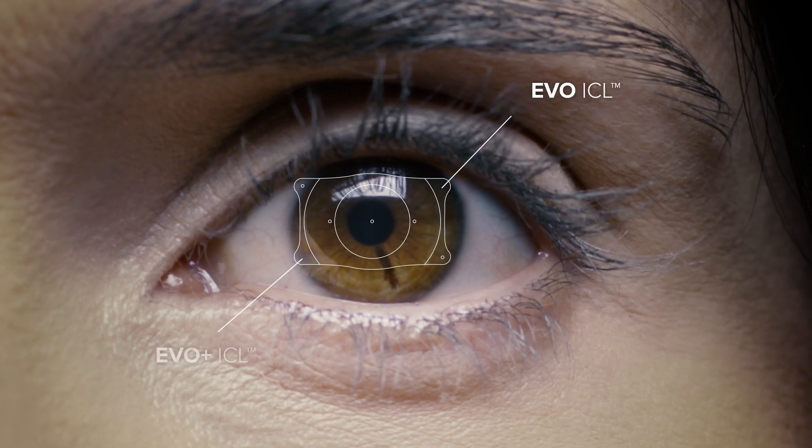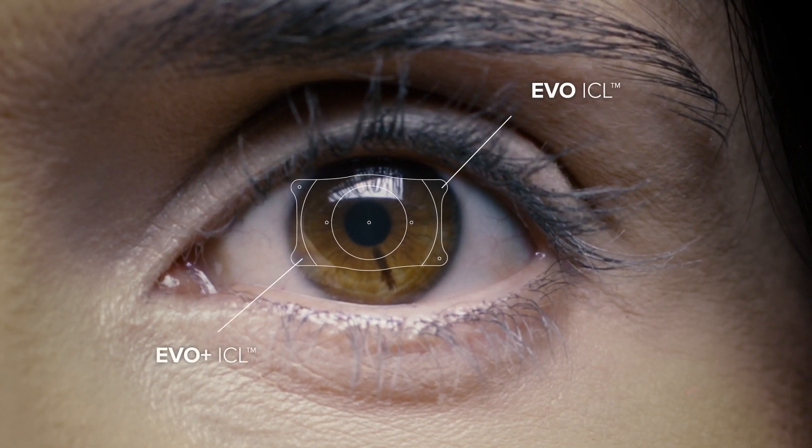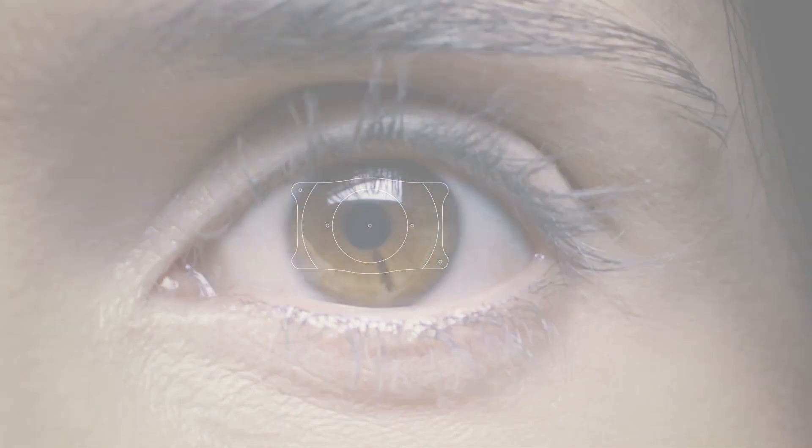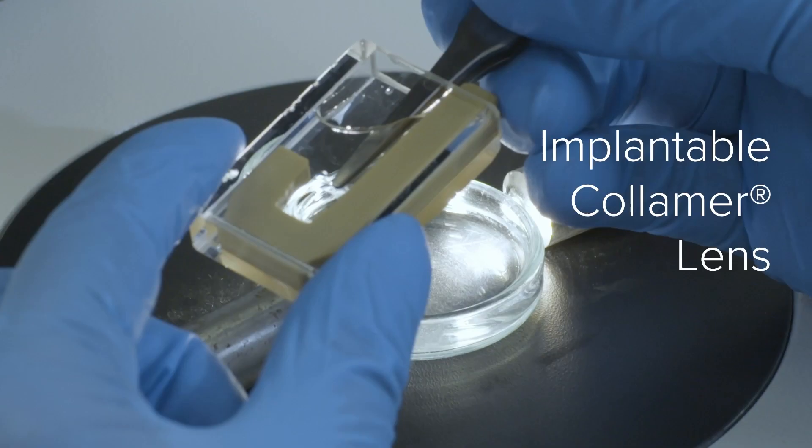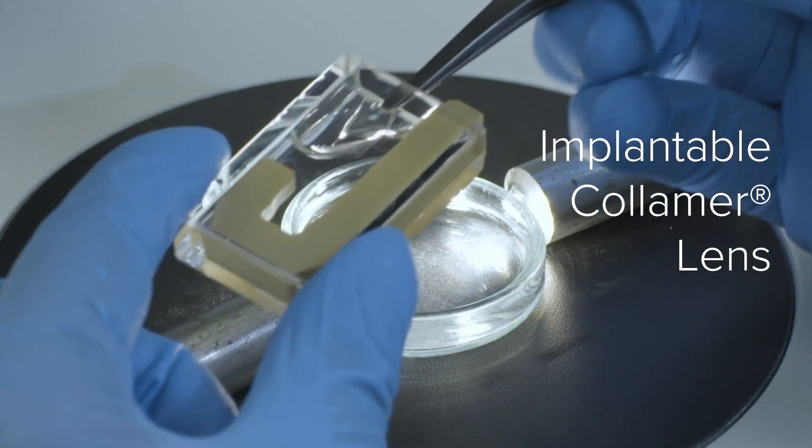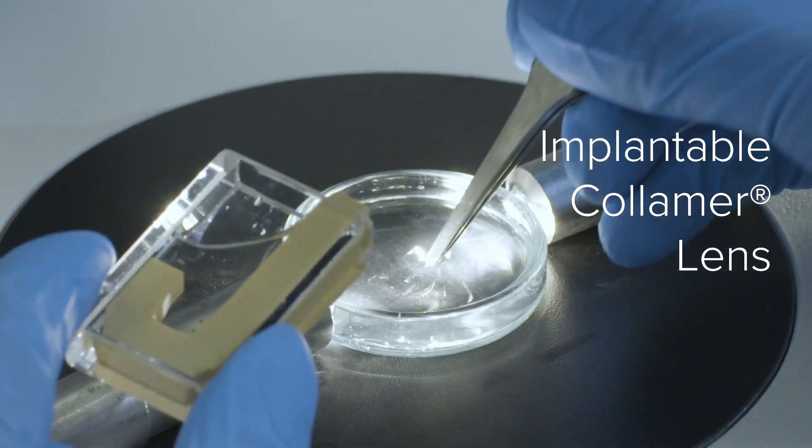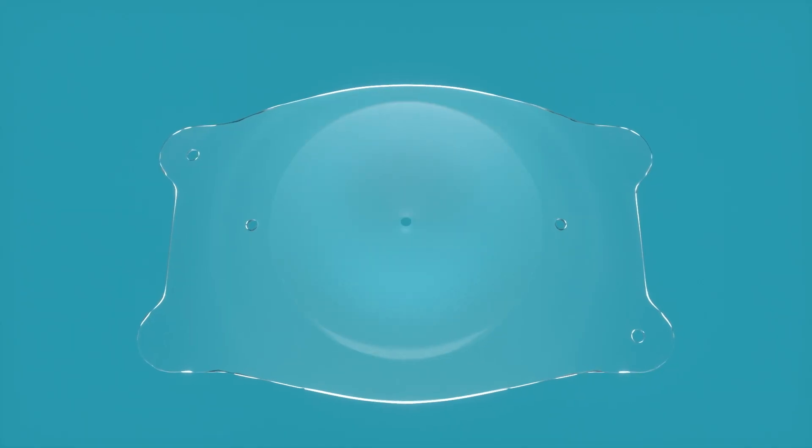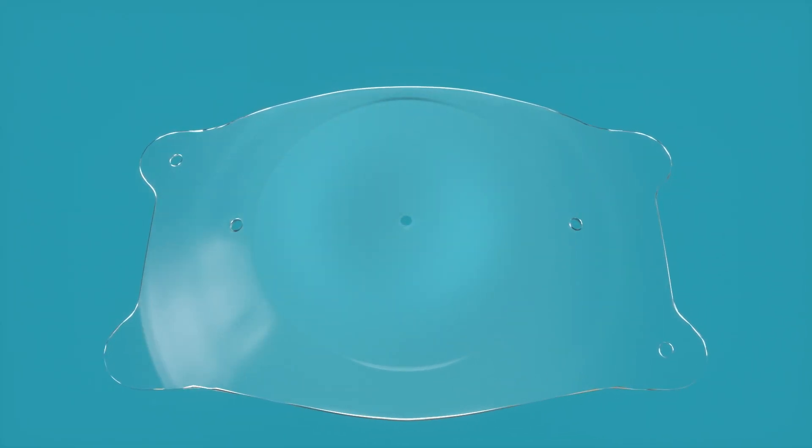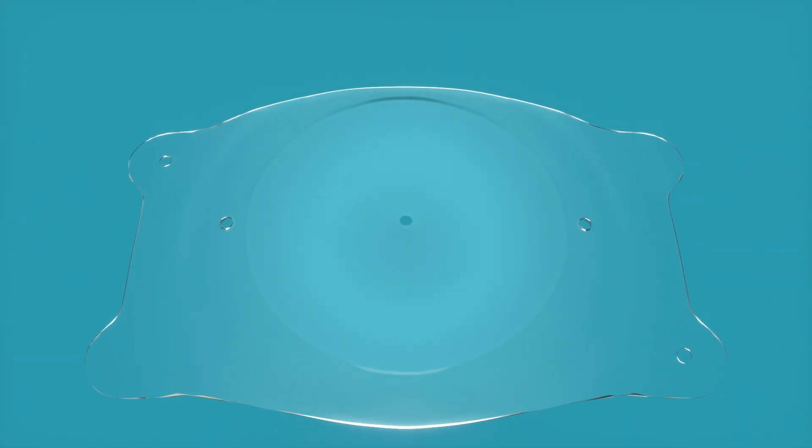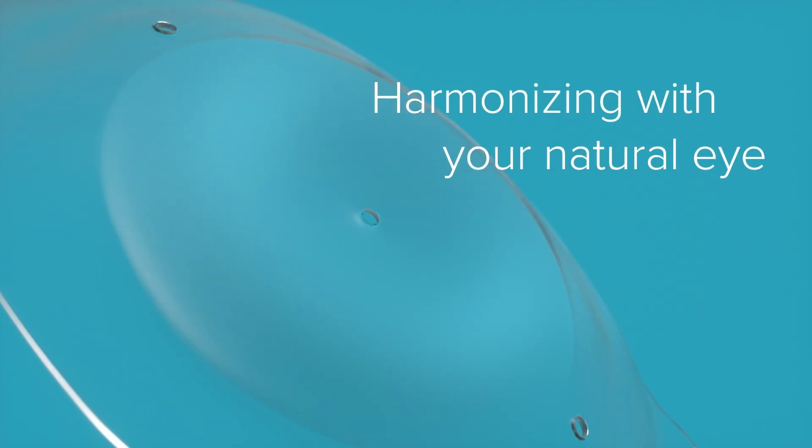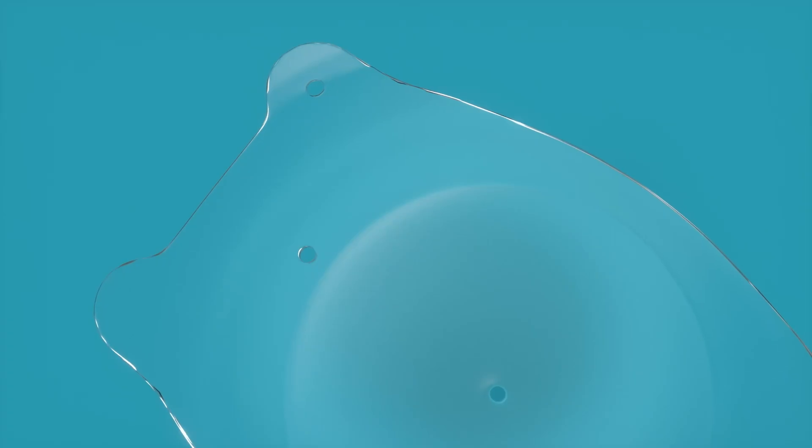The EVO ICL Collamer Lens, or EVO for short, is an implantable lens that can correct common visual limitations like nearsightedness, freeing you from glasses and contacts while harmonizing with your natural eye.